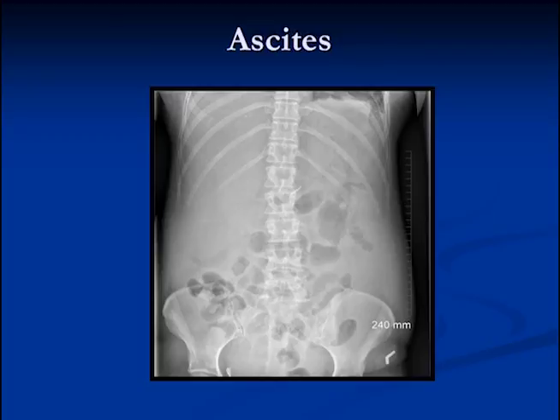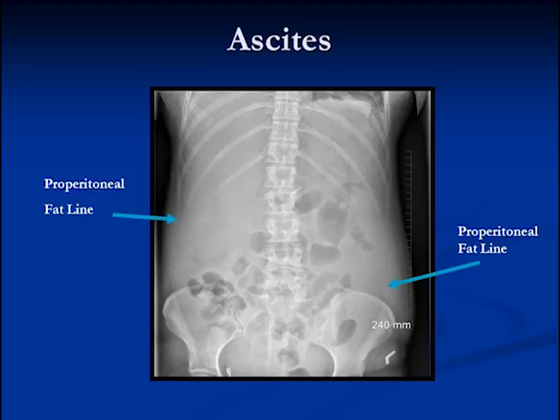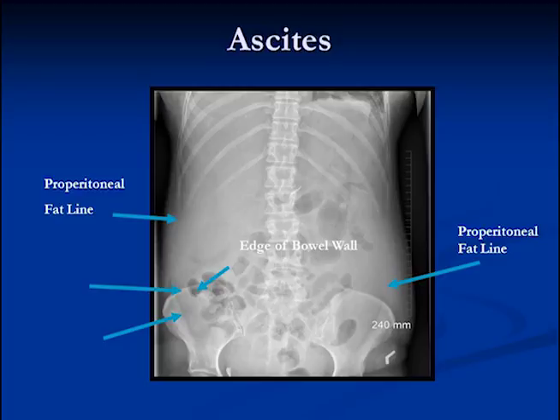When a patient gets fluid in the abdomen, there's separation of the bowel from the properitoneal fat line, as in this case of a patient with ascites. You can see the properitoneal fat line, and you can also see the edge of the large bowel — this is cecum — but it doesn't sit immediately adjacent to the fat line. In between the bowel and the fat line is fluid, and this is called fluid in the paracolic gutter, with a paracolic gutter on both sides.